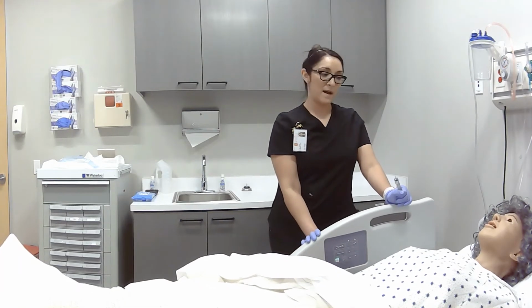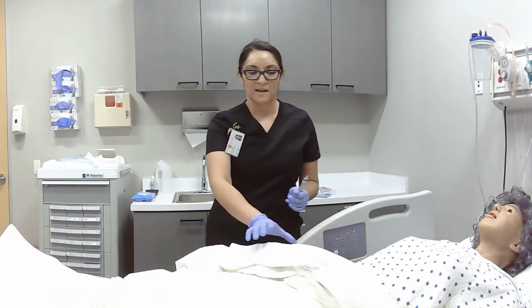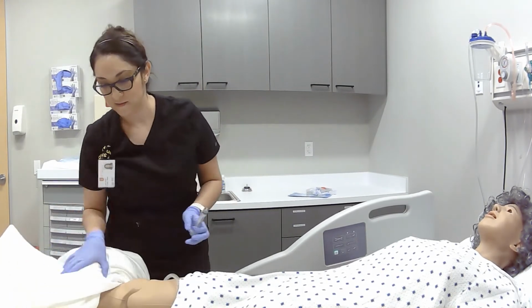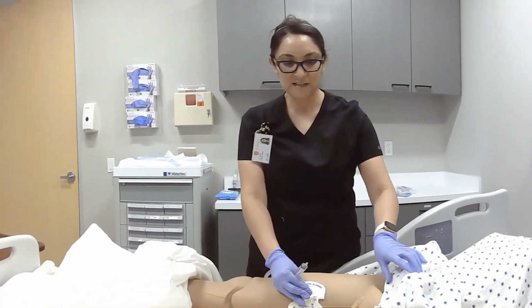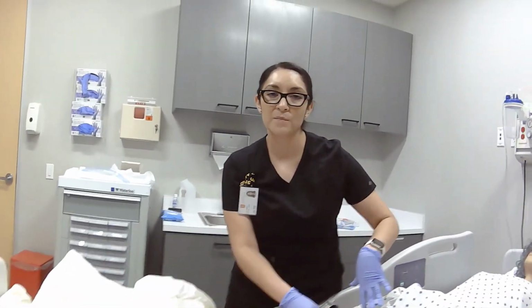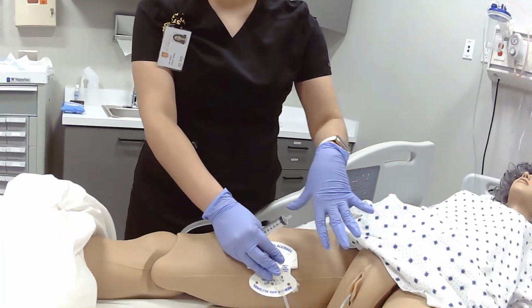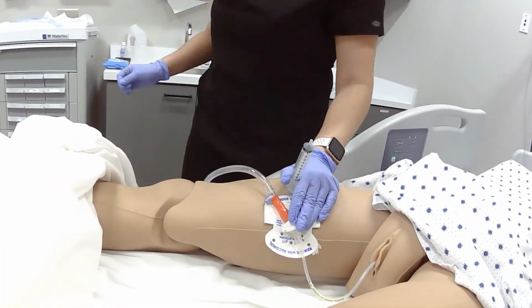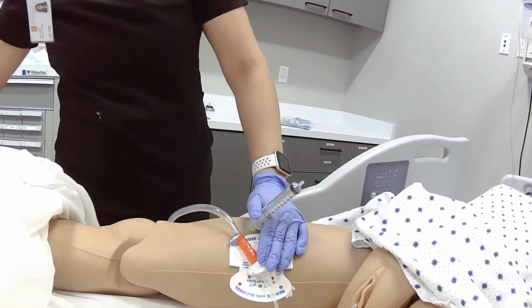So I don't hurt my back. I'm going to pull these covers back for you. If the patient is soiled or there's a lot of dirt or microbes, you'd want to wipe those off with the bath wipes like we used earlier, okay? So we would do that.